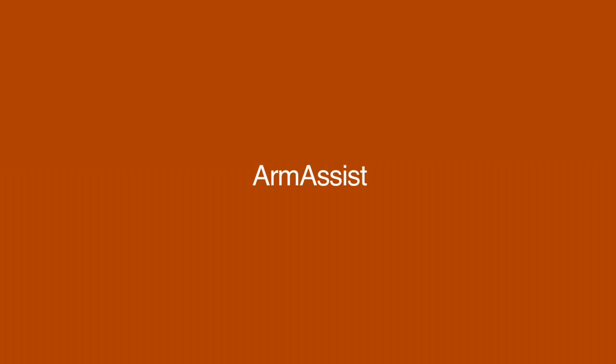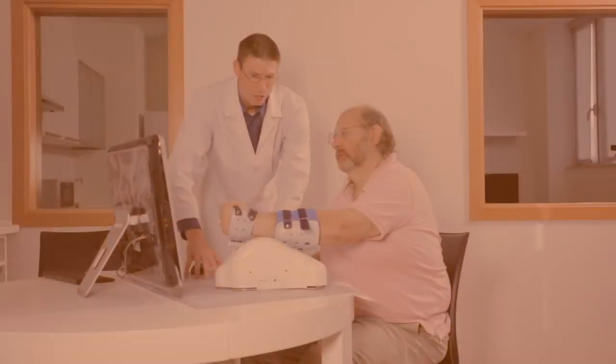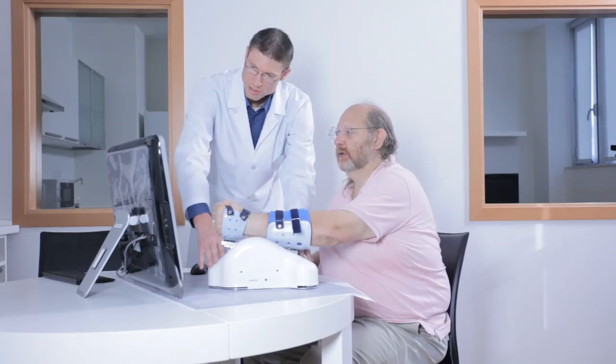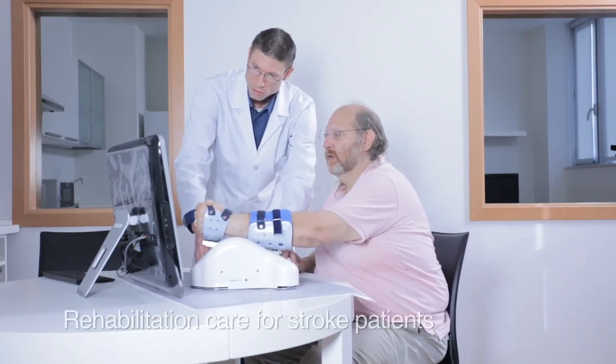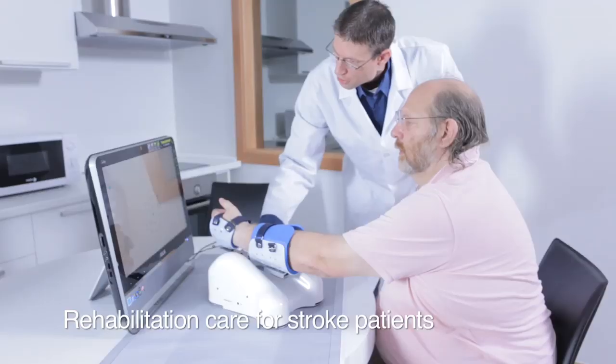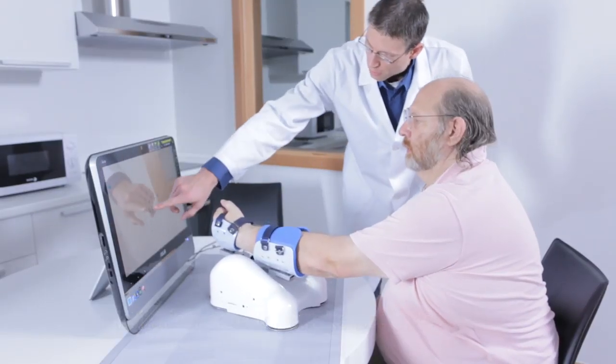Arm Assist. Robotically assisted rehabilitation increases the efficiency in the delivery of rehabilitation care for stroke patients while simultaneously improving the quality of that care.